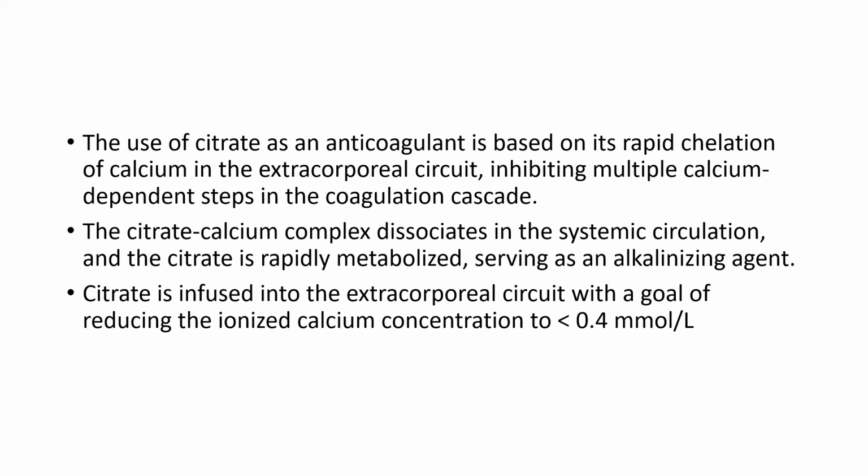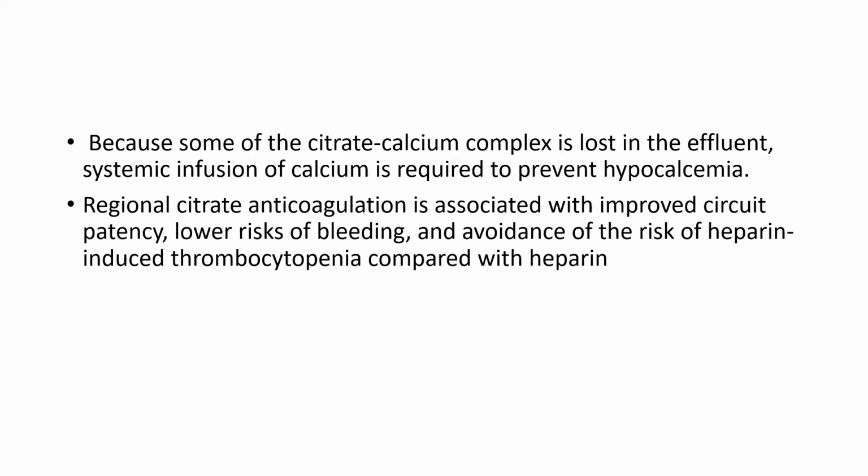Citrate is infused into the extracorporeal circuit with the goal of reducing ionized calcium concentration to less than 0.4 mmol per liter. Because some of the citrate-calcium complex is lost in the effluent, systemic infusion of calcium is required to prevent hypocalcemia.